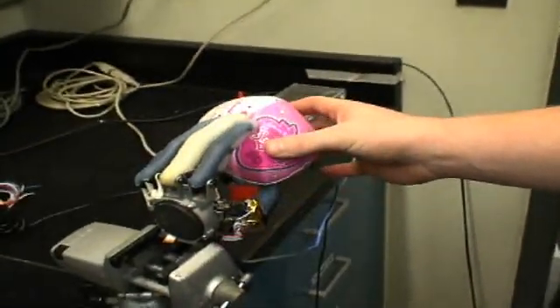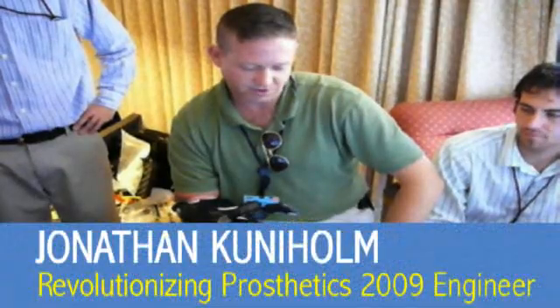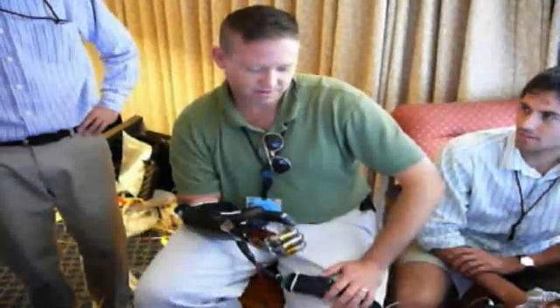The arm itself is a mechanical marvel. But how can an amputee control it? The goal is controlling the mechanical joints with the electrical activity of the residual muscles.